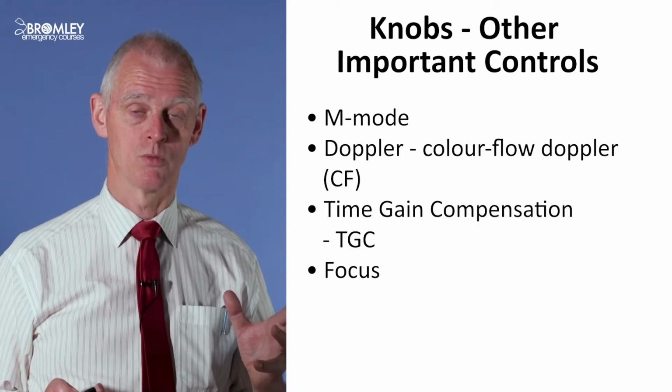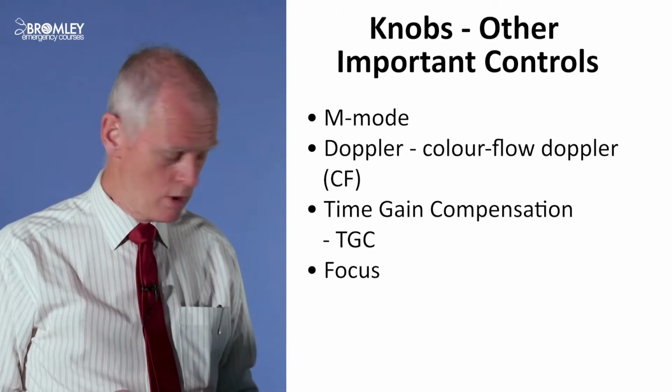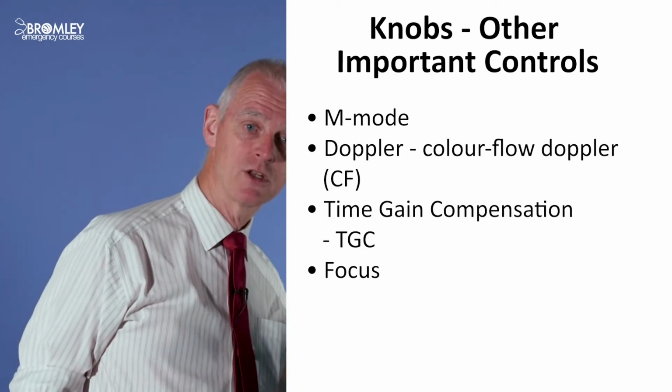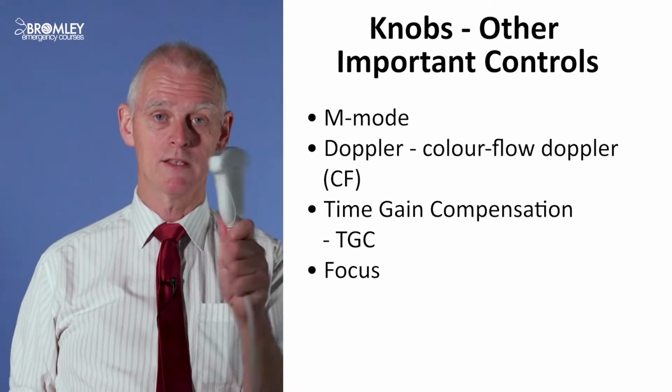But I want to go on and talk about some of the other controls that we use in ultrasound that we're going to use some of the time. And I'm going to talk about M mode, but before I do that, I just want to talk a little bit about ultrasound and how it works. So here's a probe, okay?